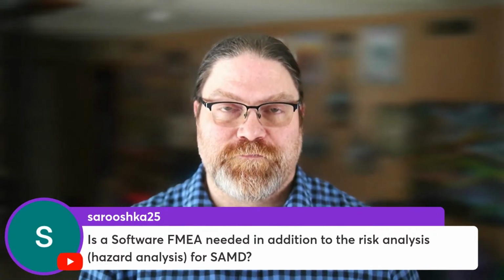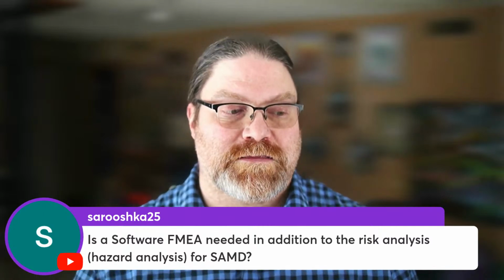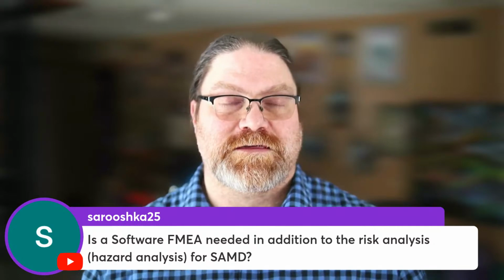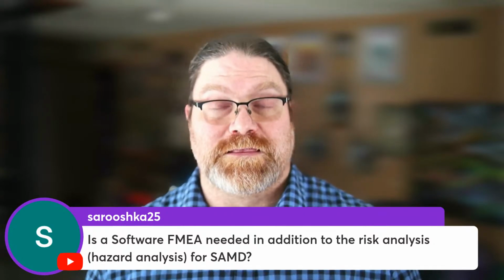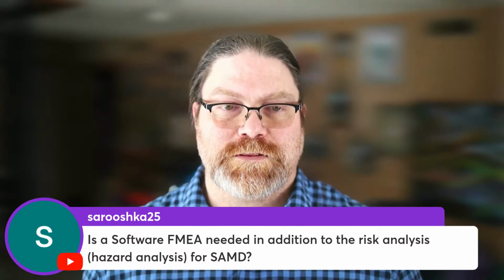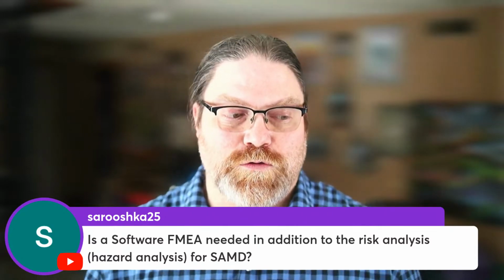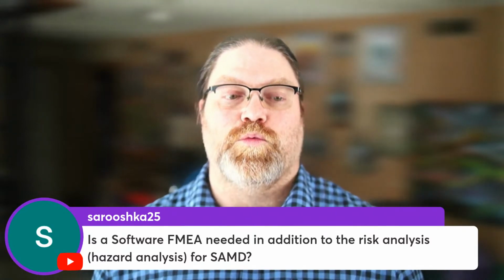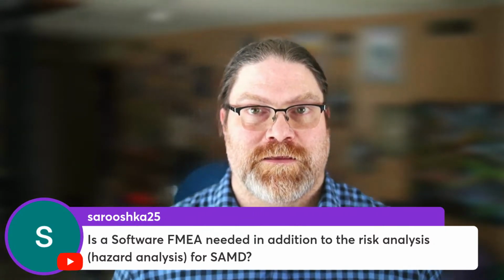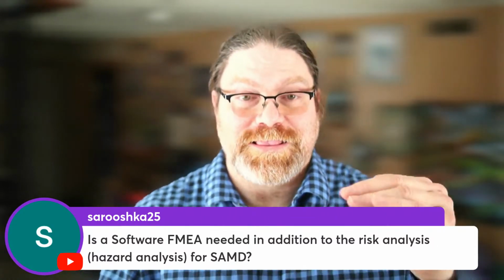So software failure modes and effects analysis, that is one type of risk analysis. So it's not in addition to, it is a risk analysis. A failure modes and effects analysis is a type of risk analysis. It's not the only type. There are fault tree diagrams. That's another type. There are multiple types of software risk analysis tools that you can use, but any risk analysis tool will be acceptable, but you should follow the standard for it. So if you're looking for a standard, look to 14971, and it lists several of them.